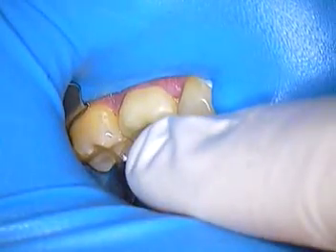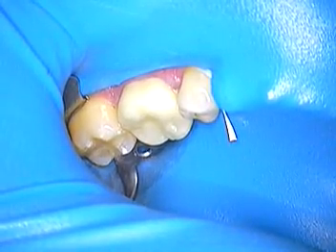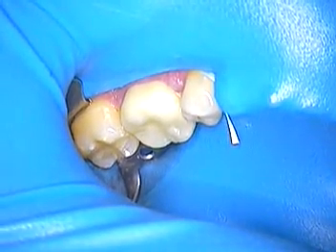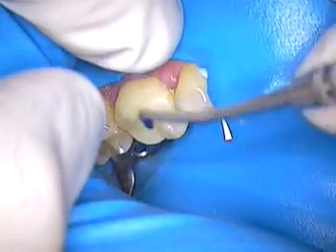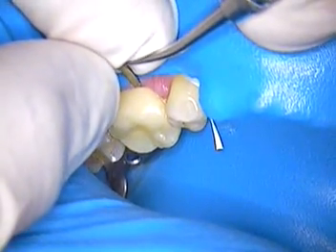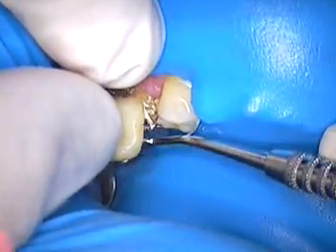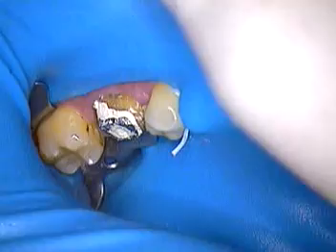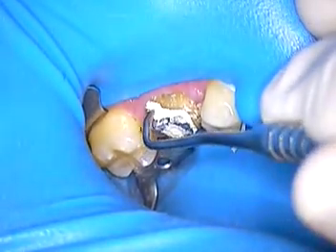So there's our temporary crown, and we're going to just gently tease that off by slotting this first. We're going to do a little slot procedure. Actually, Jen, let's try it with a spoon. Just bear with me, Pierre — we're just going to try to just pop this off. Let's see if we can just lift that up. There it comes — it's just on with a temporary cement. So this is our temporary crown, and we'll save that. That will go in a cleaner, and Julie will take care of that.